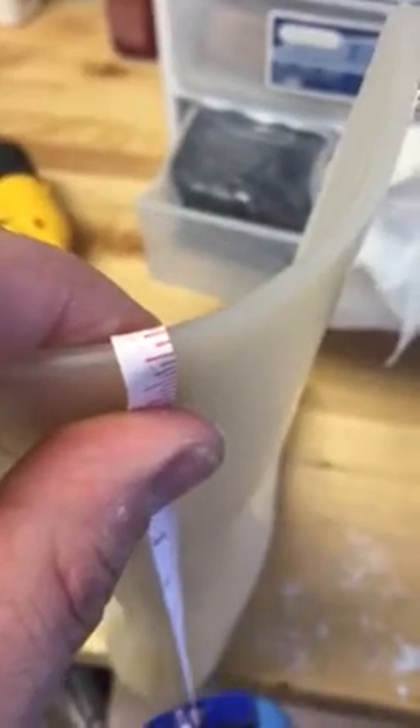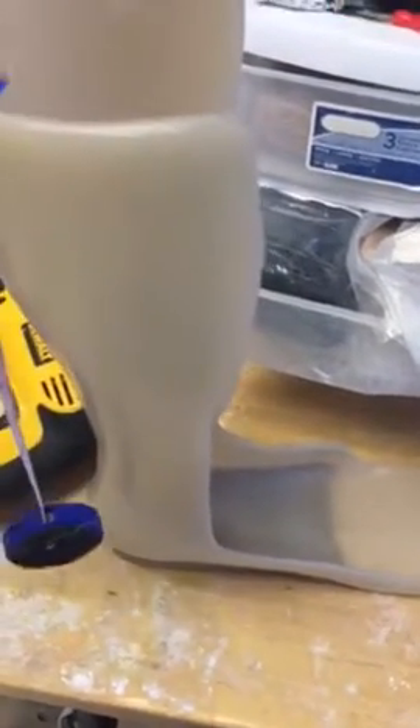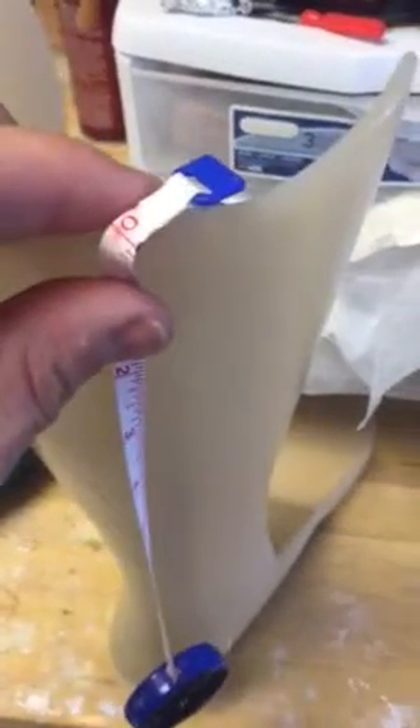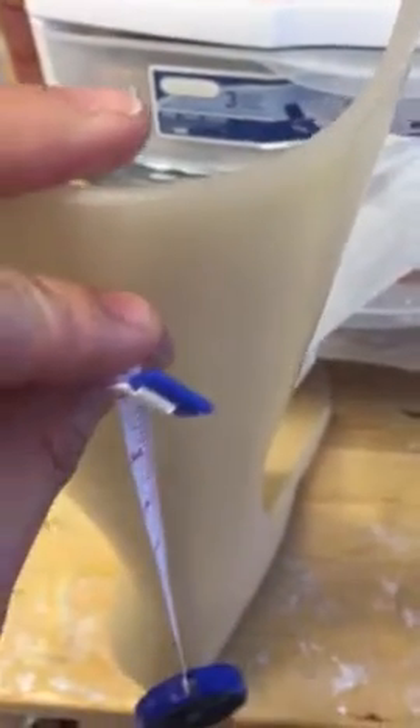Three sixteenths of an inch is typically what is used in an AFO brace for an adult. However, you might find an occasion where someone will use one quarter inch, or perhaps five thirty-seconds inch plastic.